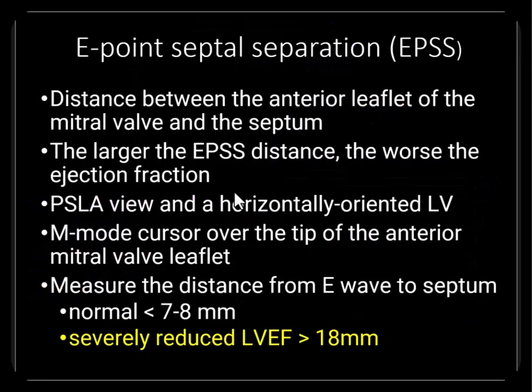Remember, this needs to be a parasternal long axis view, and I want to emphasize that you need a horizontally oriented left ventricle. We'll go over how to correct that in just a moment if you have more of a longitudinally oriented left ventricle. But remember, it needs to be more horizontal for that measurement to be accurate.